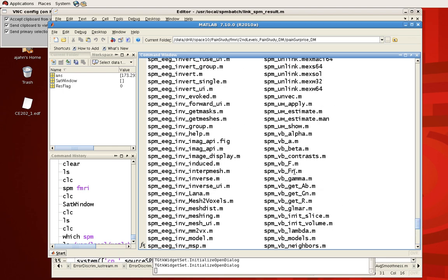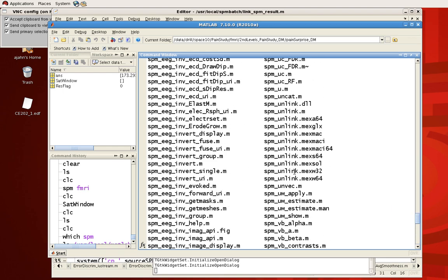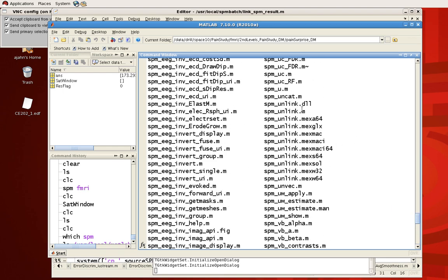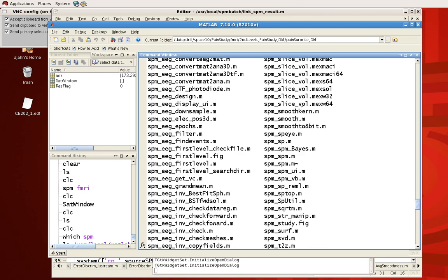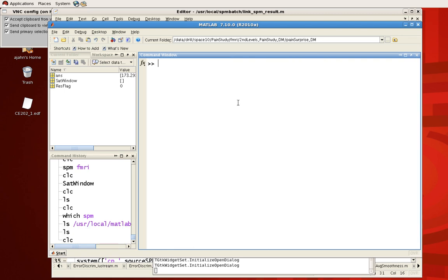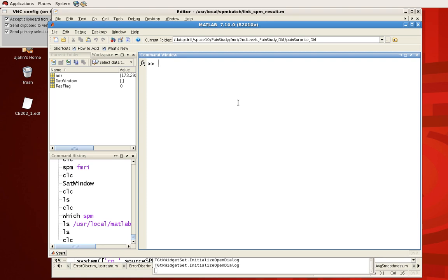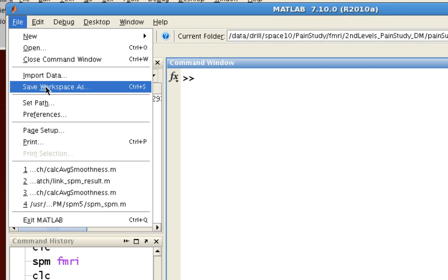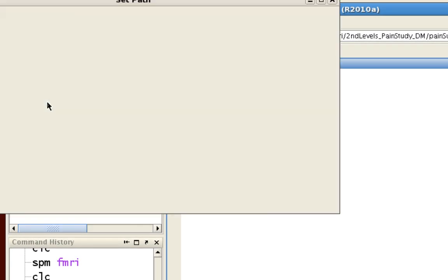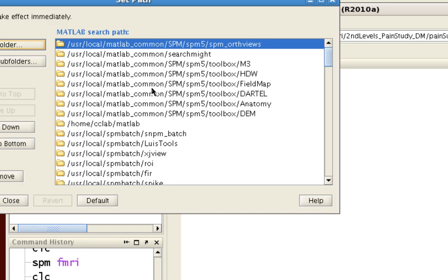So we're gonna look within this path right here, really quick SPM 5, and you see these are all the different commands that SPM will call upon when you do any kind of fMRI analysis. So you can see things like SPM unlink, SPM SPM, everything.